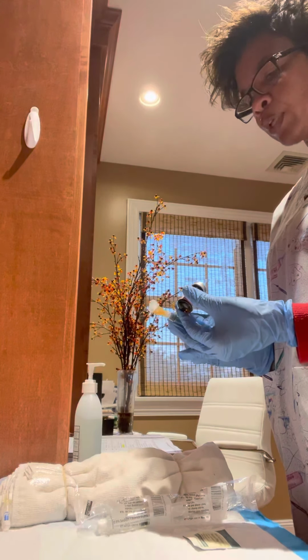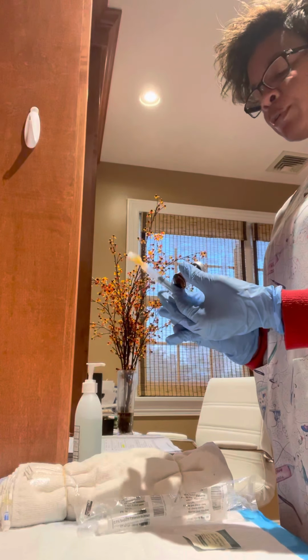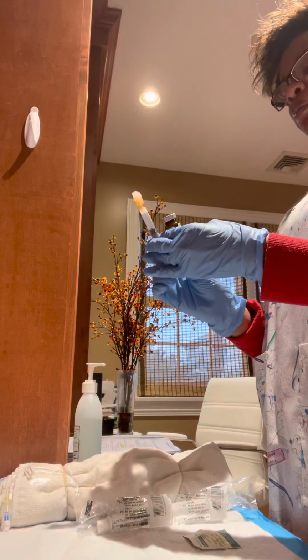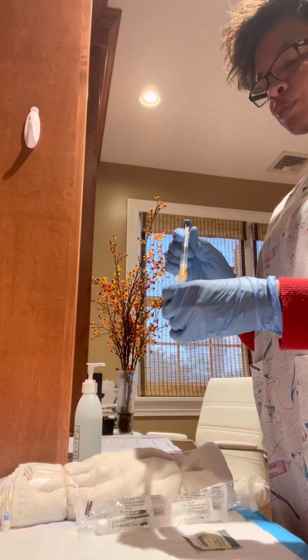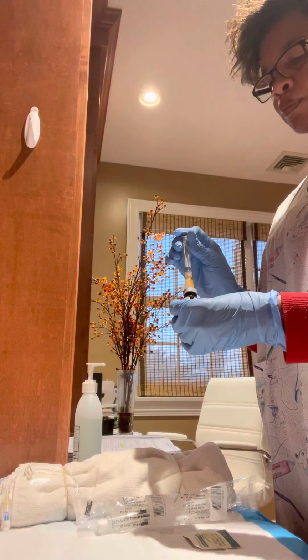So then I always like, whenever I'm pulling up meds, I just kind of put air. So I'm holding this to make sure it's going to be 2 ml. So then I would just, like that, put air.